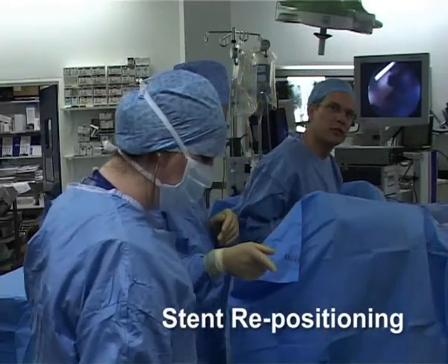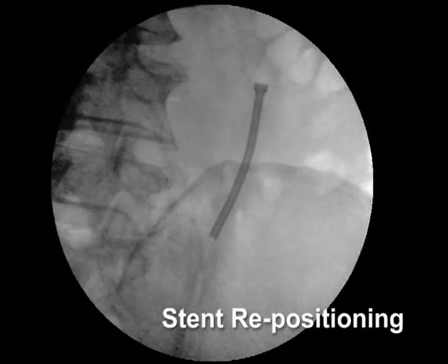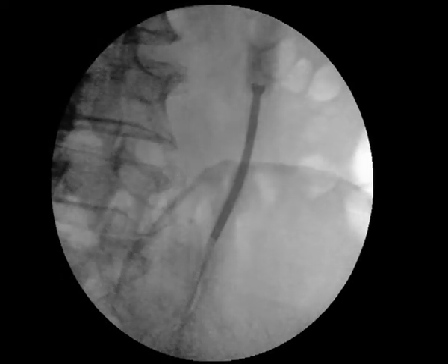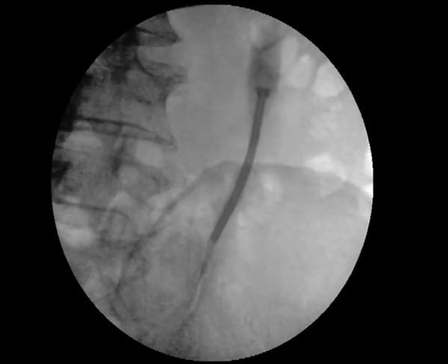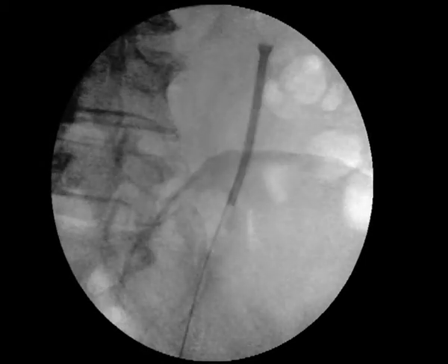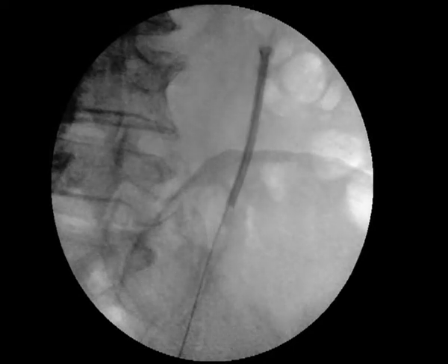It may be necessary to adjust the stent position. As before, a contrast study confirms the patency of the migrated stent. A soft guide wire is carefully manipulated through the stent.